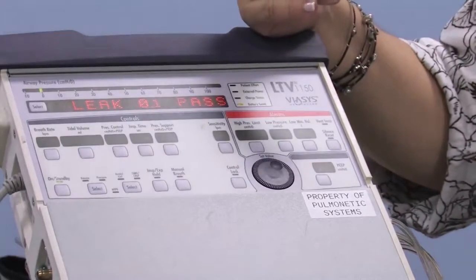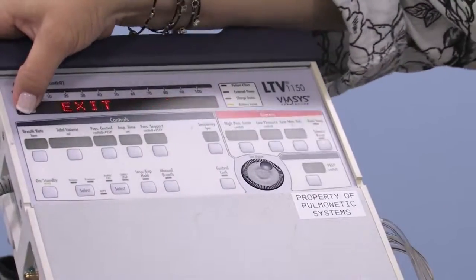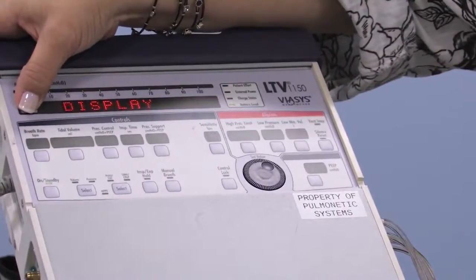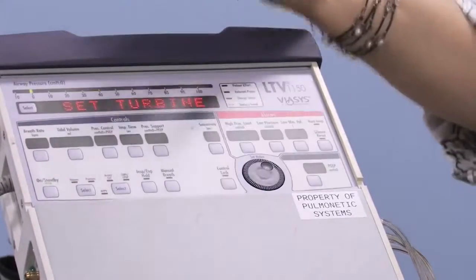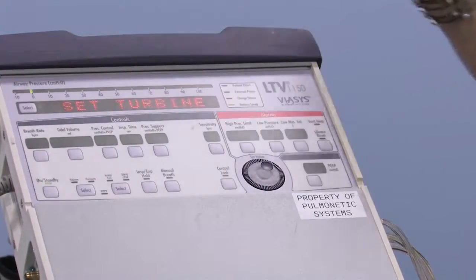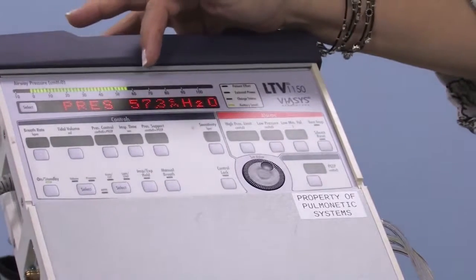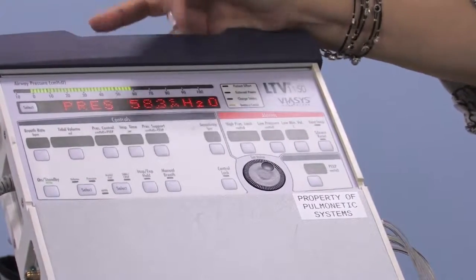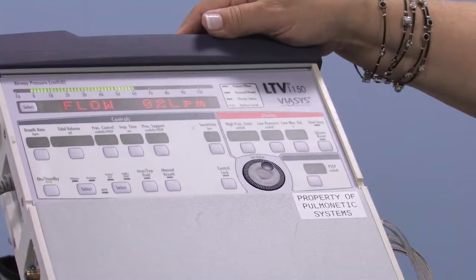What if we fail? We can tighten all the connections and push the button and go around again. Go around all the way to leak and do it again and hope that we pass. If continually we've tightened things and we can't find the leak anywhere, we're going to try a different circuit. So you see it does a pressure check, then it looks for a leak in liters per minute coming out somewhere. So if I make a big leak, you'll see it.